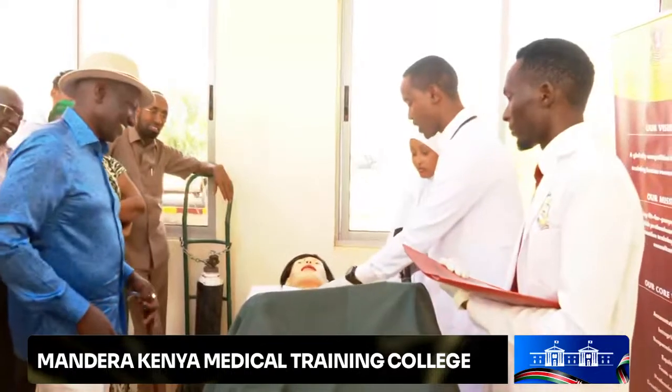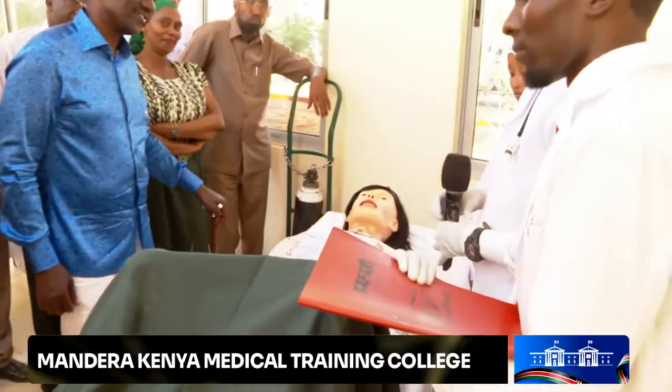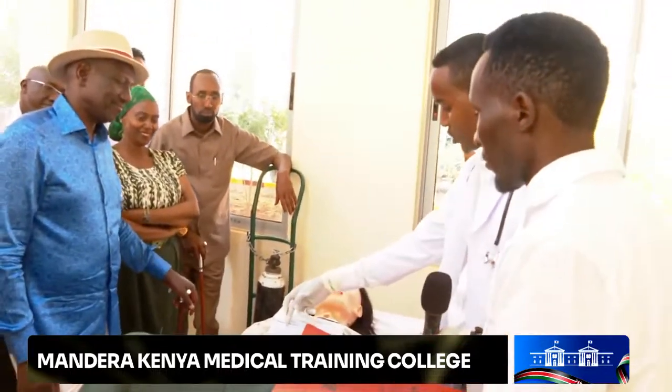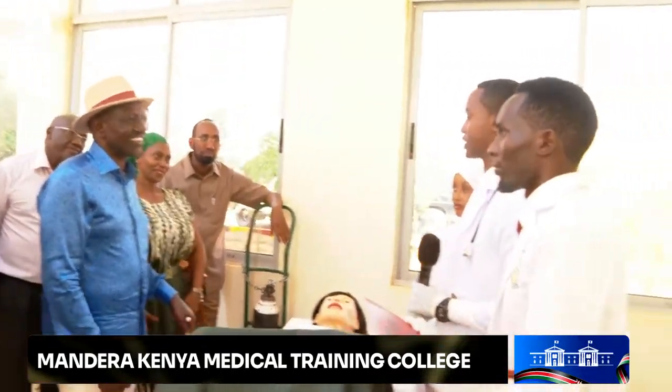So this one is a urine bag. We will accumulate the amount of fluid that will come from the bladder, and we have the measurement ranges here. It will help us in knowing how much fluid we got from this patient. And that is how the procedure is, Your Excellency.